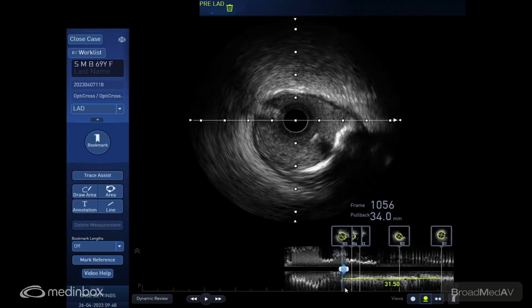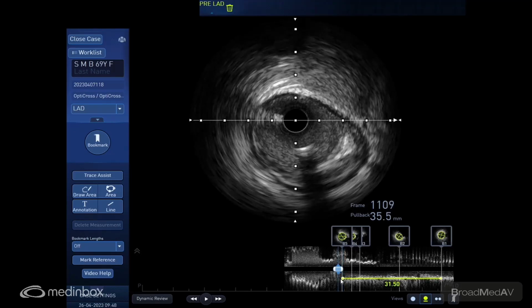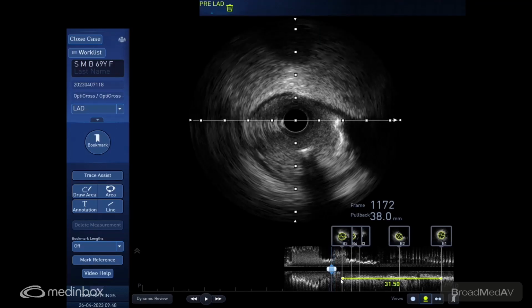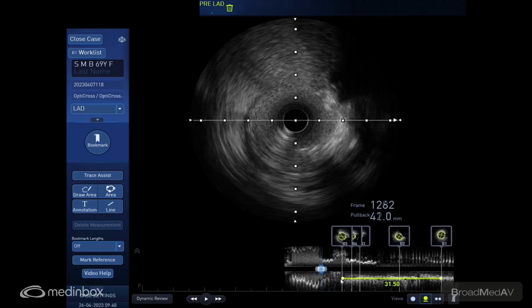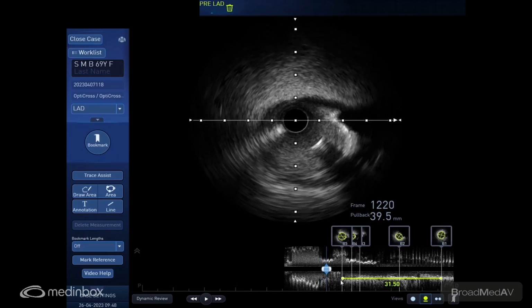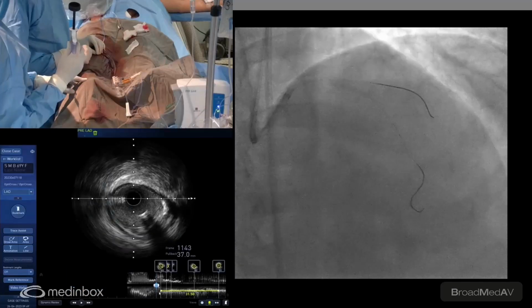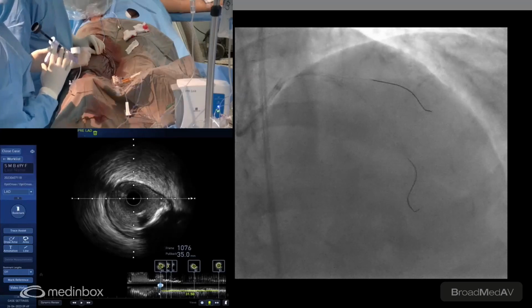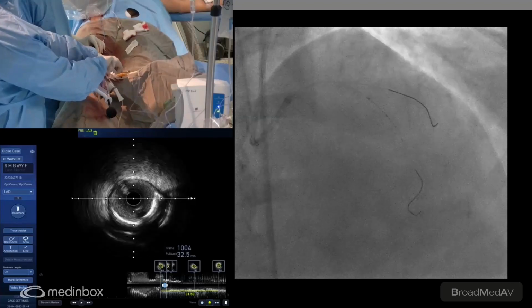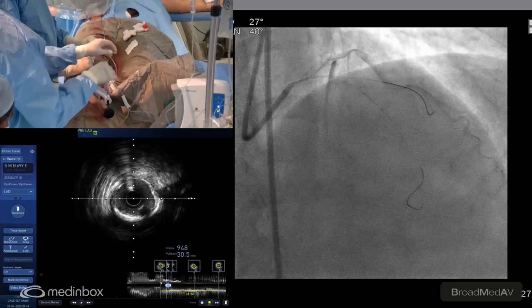Keep the IVUS ready after this, please. Yes, sir. One check, please. Go up, please. Got it.